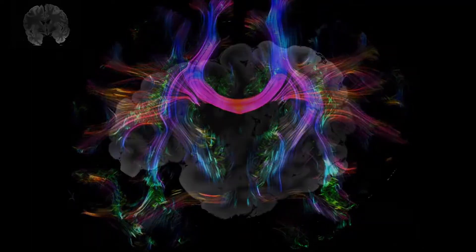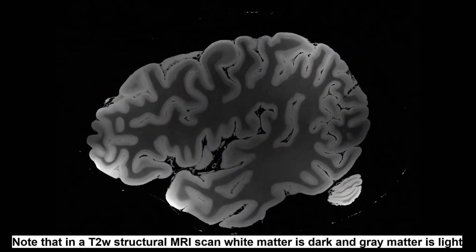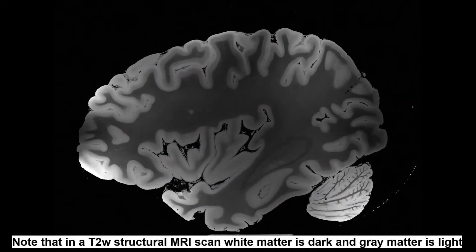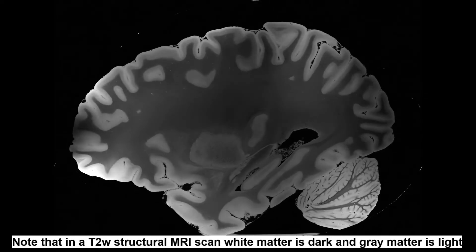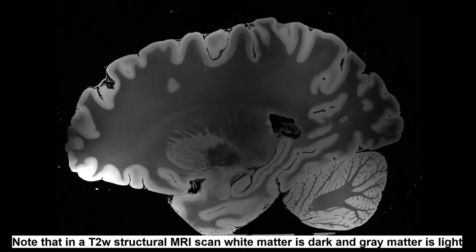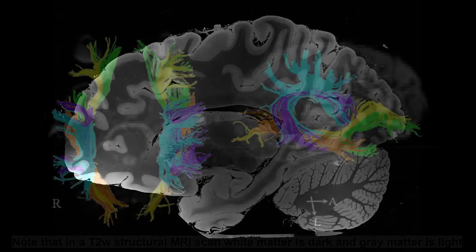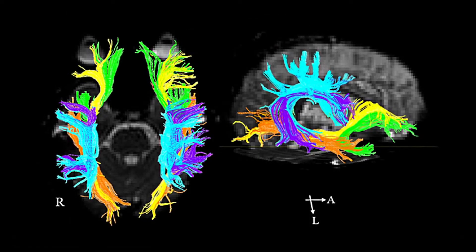With a standard structural MRI scan, white matter can be identified. However, it is very difficult to actually see the different connections and along which direction different axonal bundles are going. For that, we need DTI.